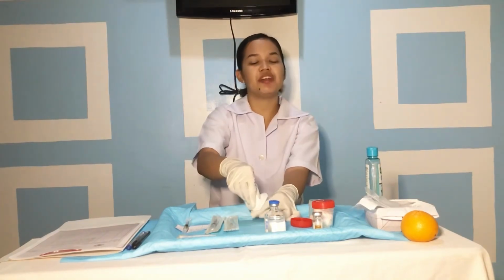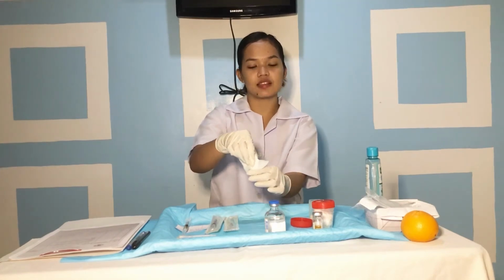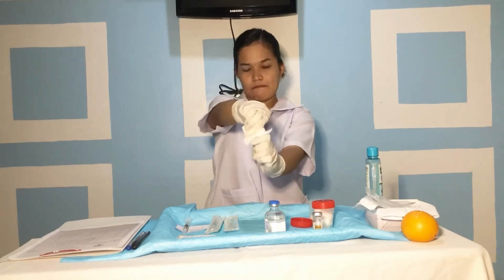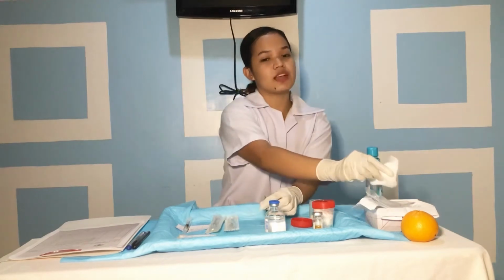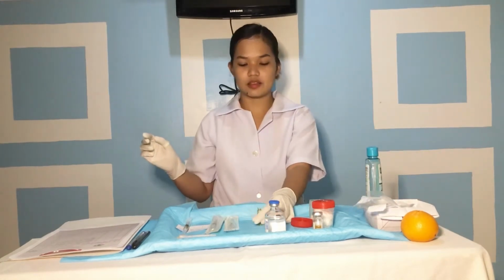Placing a pad around the neck of the ampule protects our fingers from trauma as the glass tip is broken off. This will protect our fingers and face from shattering of the glass.